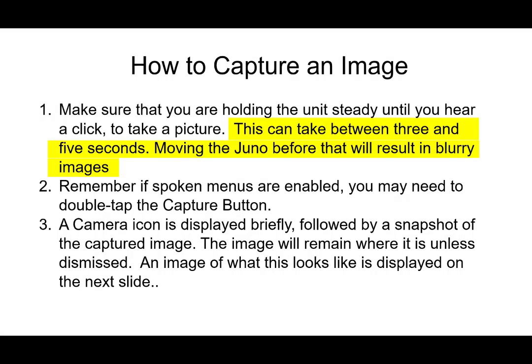And it's important not to move the Juno until you've heard that click, because if you do, the image that you capture may be blurry, and it's also probably going to be hard to capture with optical character recognition and probably really hard to see. After you have captured the image, there's going to be a camera icon displayed very briefly, and once the image has processed, that screen will go away, and the snapshot of the captured image will show up and remain where it is unless it's dismissed. An image of what that's going to look like is on the next slide, and we'll talk about the buttons that will show up once we've captured that image as well.